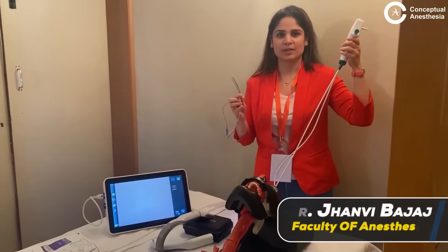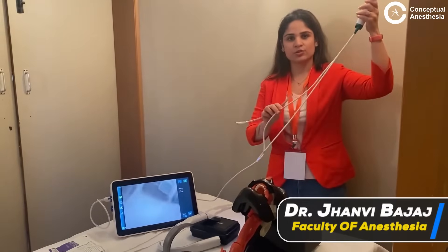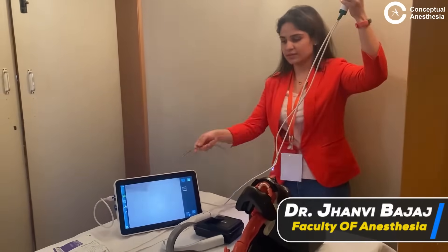Hello and welcome to this show. I am Dr. Chandni. I am going to show you how to use a fiber optic scope with the monitor.